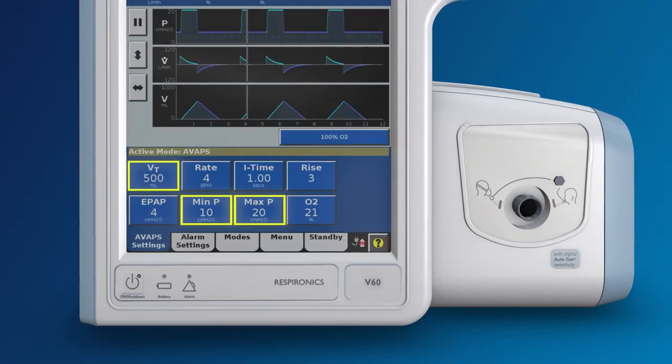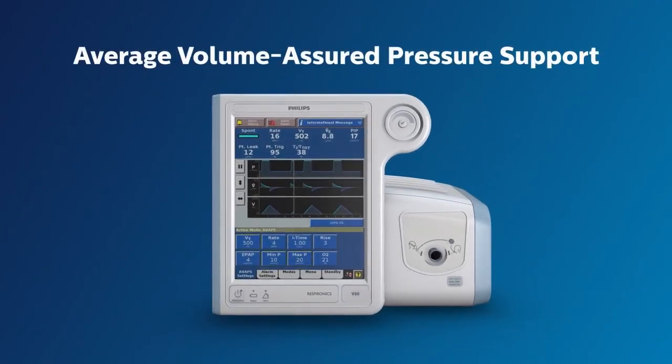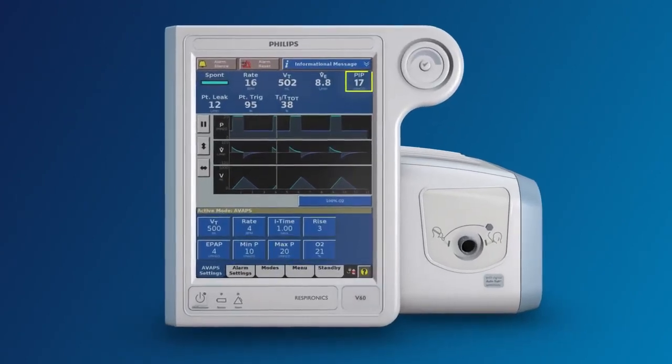In other words, we are allowing the IPAP to adjust itself between an IPAP of 10 to 20 in order to assure an average targeted tidal volume of 500 milliliters over one minute. This is what AVAPS stands for: Average Volume Assured Pressure Support. In this example, the V60 used an IPAP of 17, which is in our range, and the volume was very close to 500 milliliters.